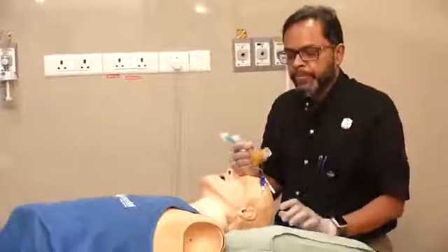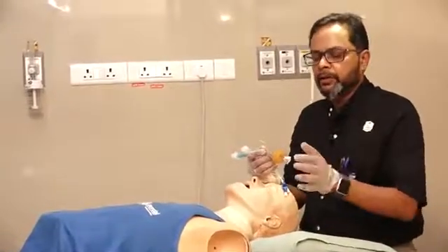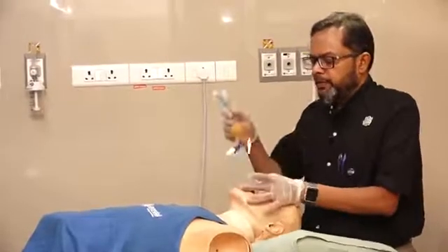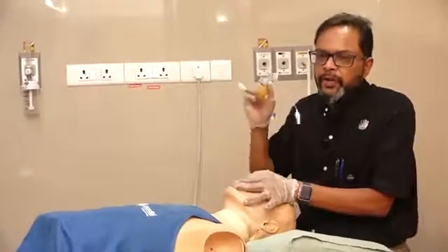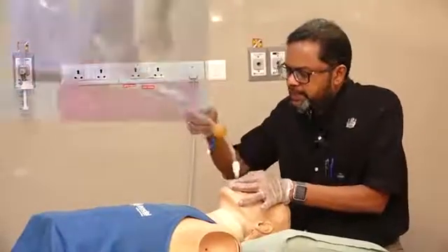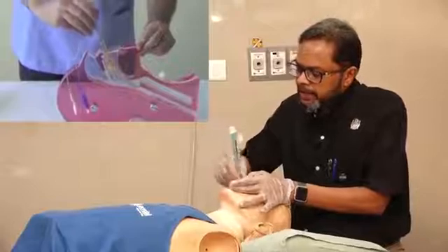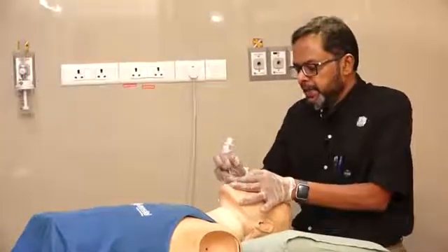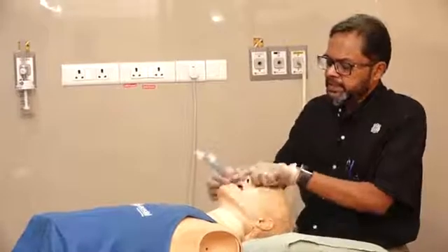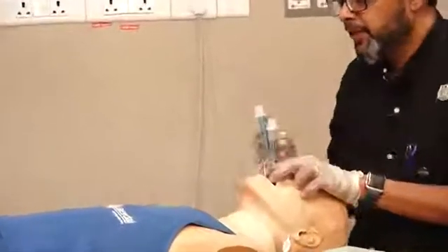For insertion, you apply some jelly on the cuff, open the airway, and blindly insert the tube — no laryngoscope is needed. Insert it until you get resistance. At that point the tube is in position and you can see the marker is at the incisor level.